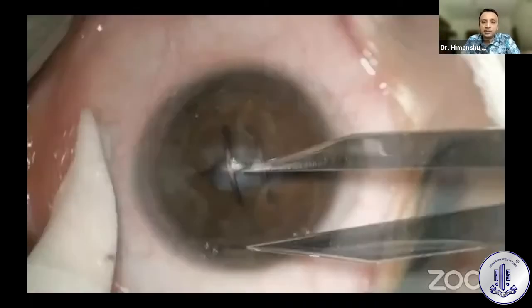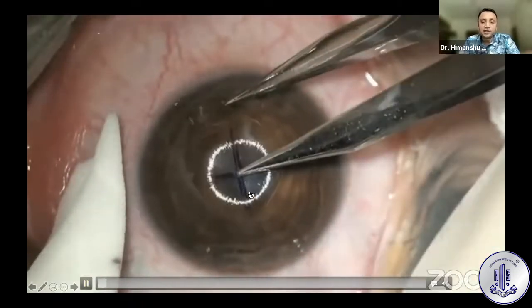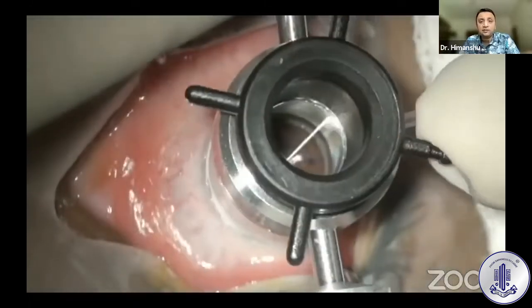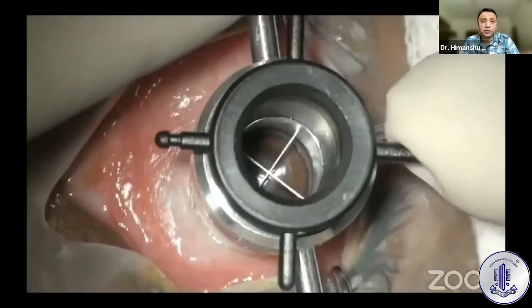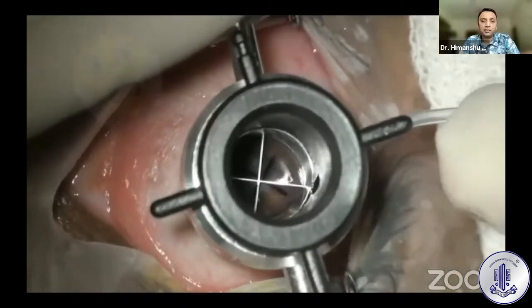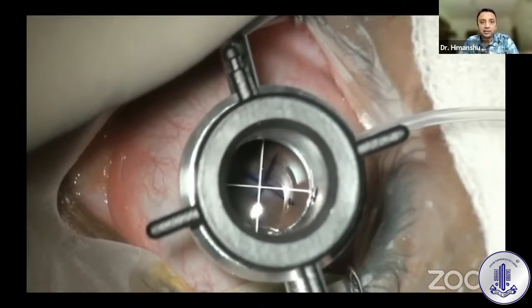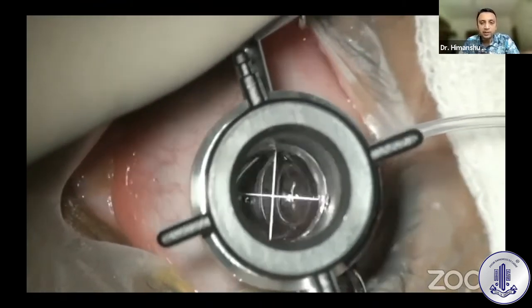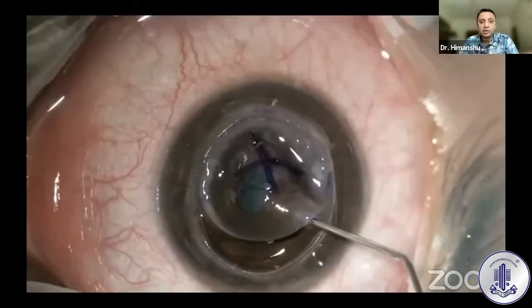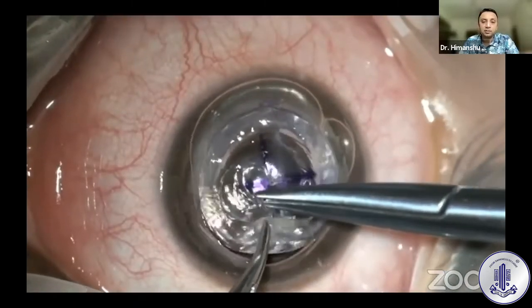One such case I'm showing here, an uncalibrated vacuum trephine which I used, and I had not used this trephine earlier as many times. I used to use the Katena trephine, and this is a corneal trephine. And I ended up with 4 quarters only. I just ended up with perforation. And mind you, I had made sure that the blade was retracted properly and everything, but somehow this trephine didn't work in my hand. With more than 200 degrees of opening, well, the only possible thing was to do a PKP.